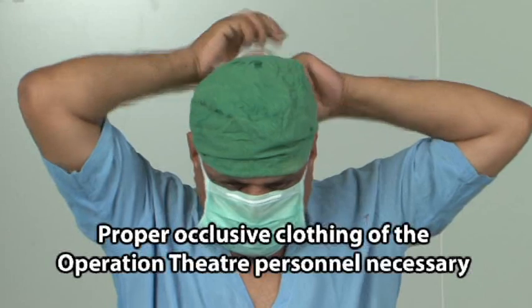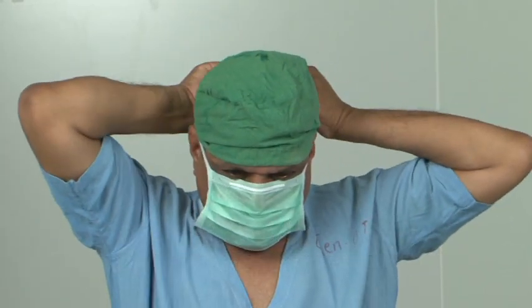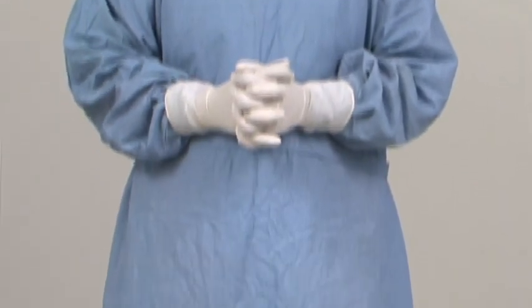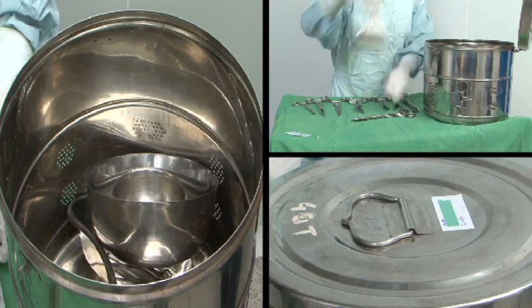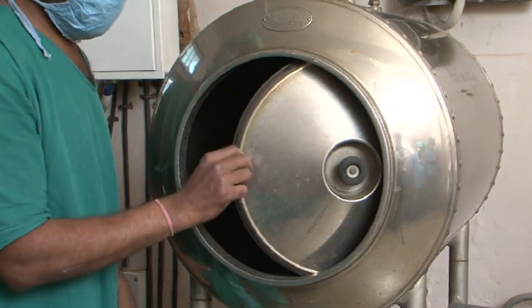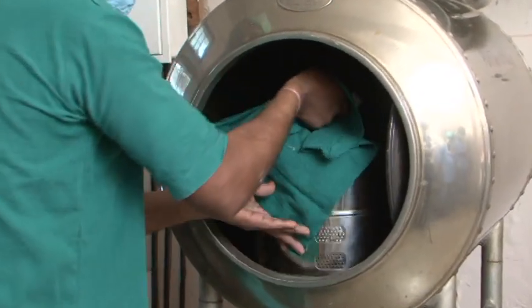Proper occlusive clothing of the operation theatre personnel necessary. The instruments should be kept properly in the drum and then sterilized by autoclaving. Each case should have separate instrument sets.